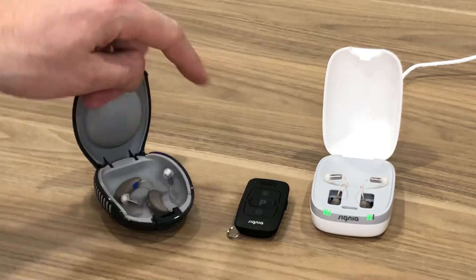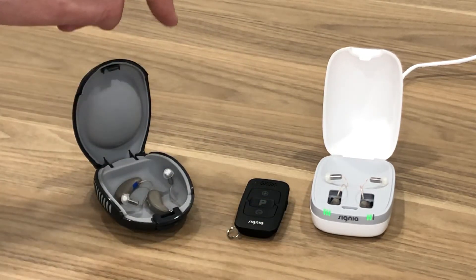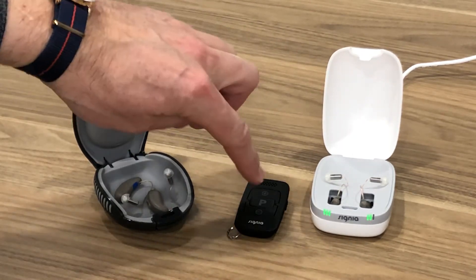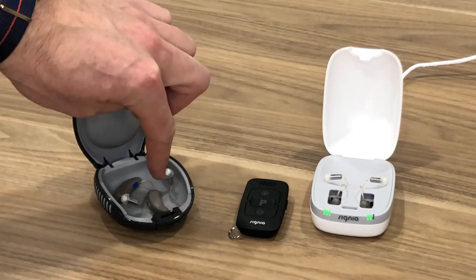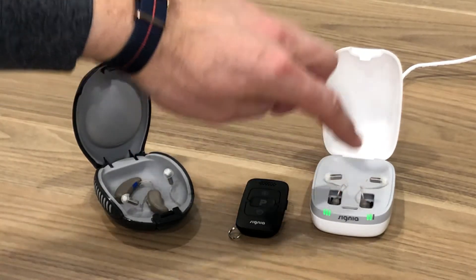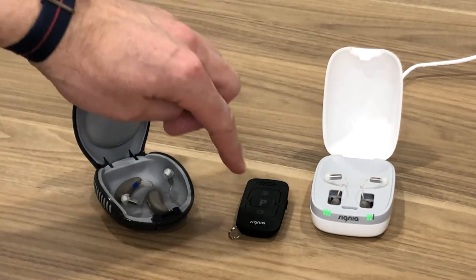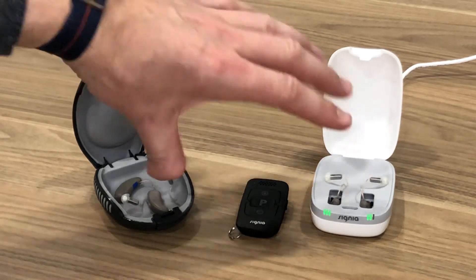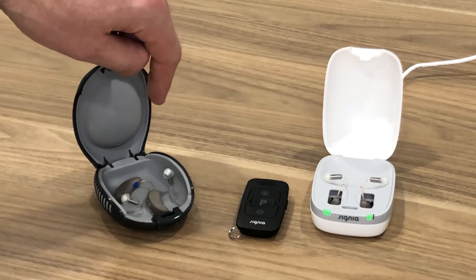In today's video I'm going to show you how to pair the remote to the hearing aids. When we talk about pairing, what it means is once this remote is paired to these hearing aids it would only control these hearing aids. So if you're out in public and you're using your remote, you're not going to be adjusting people's hearing aids around you if they have a similar product — they're matched to the specific hearing aids.